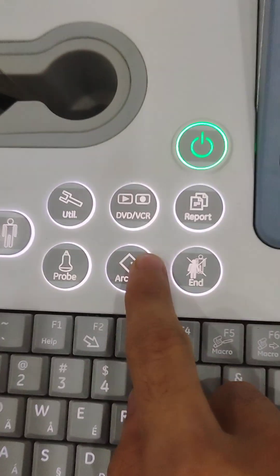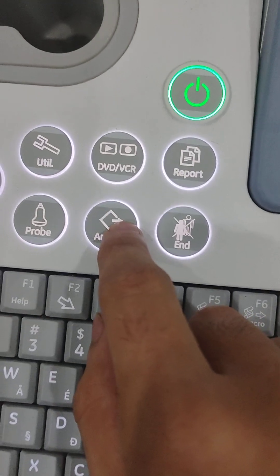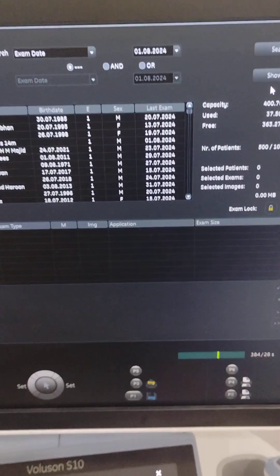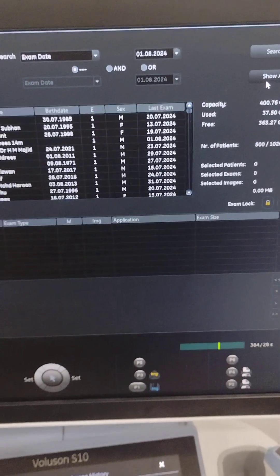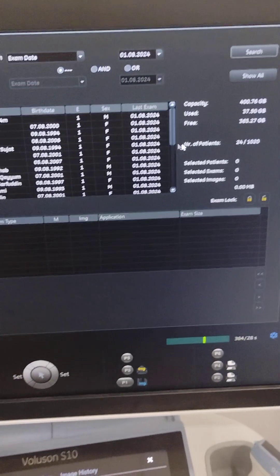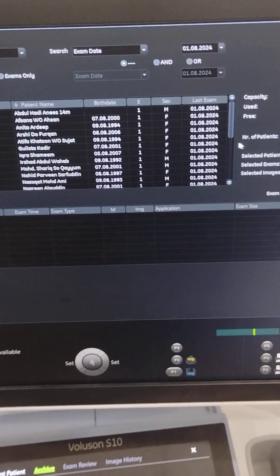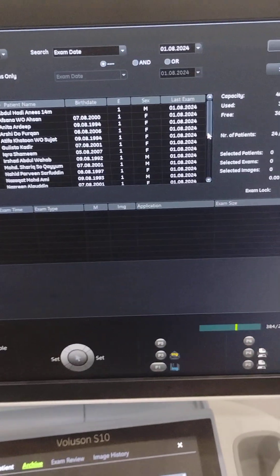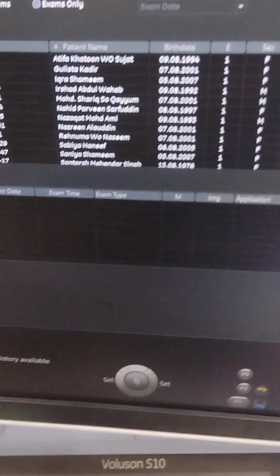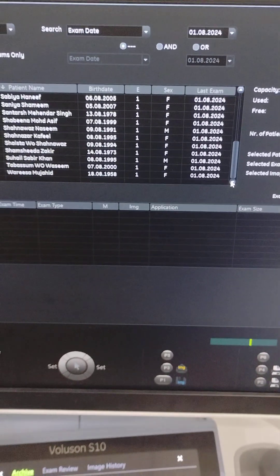You just use these buttons. This is the archive button. When you press this archive button, there comes the list of all the patients who have been diagnosed. You go here and search, and then you just drag down like this. This is how you search any patient, any particular name of a patient.